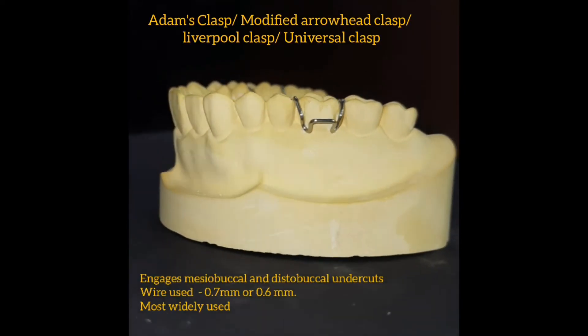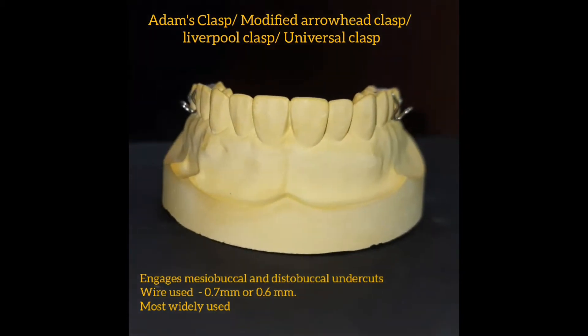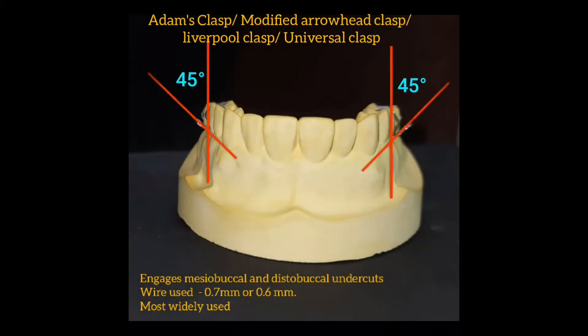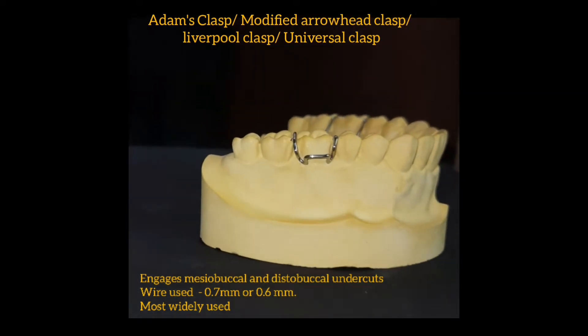So here's the design. Adam's clasp engages the mesobuccal and distal buccal undercuts of posterior teeth. The bridge is at a 45 degree angle from the vertical axis of the tooth and it has different parts such as the bridge, the arrowhead and the million dollar bend.